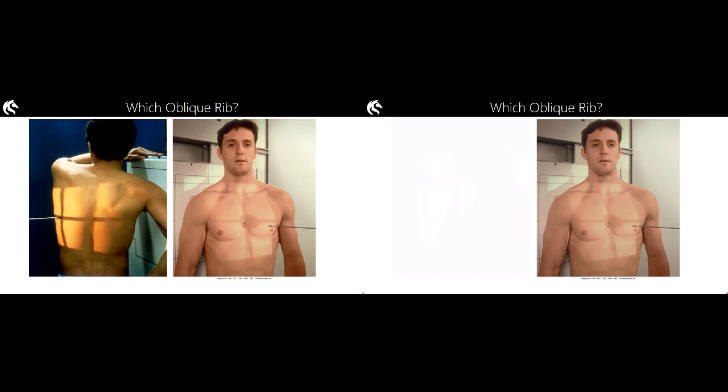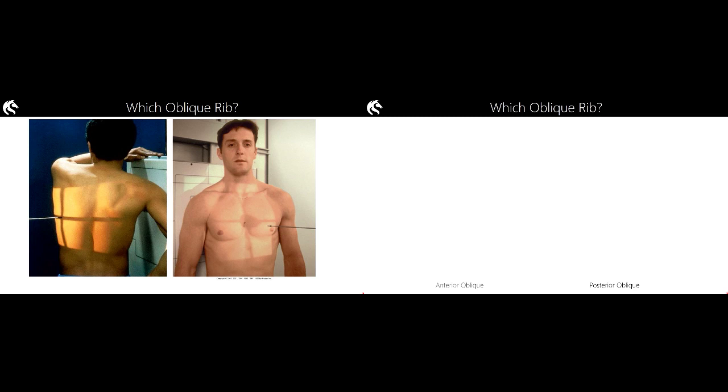So, if I were to ask you in an exam, or indeed ask you in clinical practice, which oblique of the ribs you should do, I'd like you to answer in terms of your principles, okay? Get that body region as close as possible, and oblique them enough to be able to show the structure without superimposing other structures, okay? Now, because a patient can have an injury over the entirety of that semicircle of rib, so much of rib radiography is a real make-it-up-as-you-go-along sort of thing, okay?